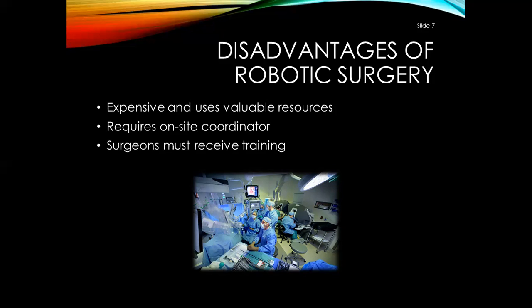We talked about haptic feedback a little while ago. Let's talk about it again, because haptic feedback comes into play here. If you remember, haptic feedback is sensing the sense of touch. So what does the absence of haptic feedback mean for surgeons being retrained on remote instrument manipulation? During robotic telesurgery, the surgeon must rely on vision alone while manipulating the hand and foot controller. So you're still missing that haptic feedback, but some of the newer robots they're developing now are actually starting to see if they could add that haptic feedback to the robot, okay?